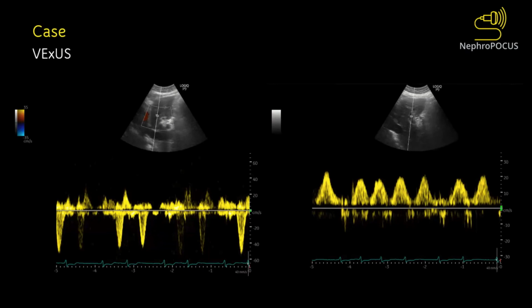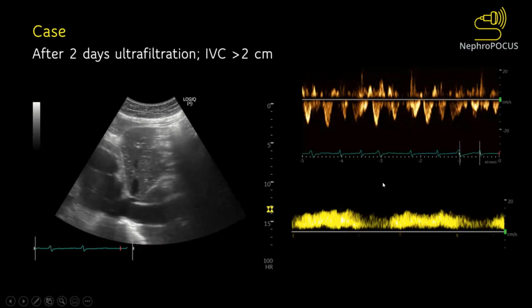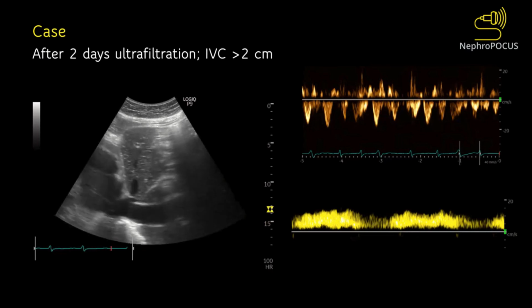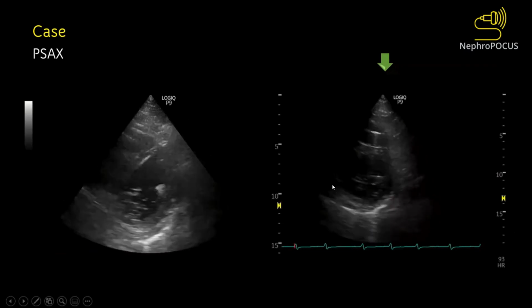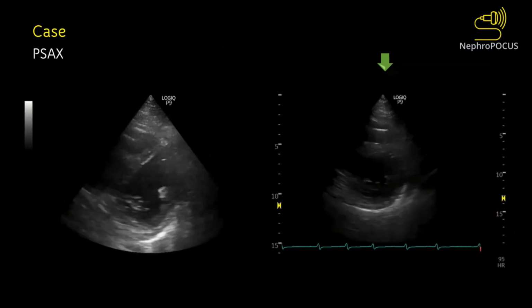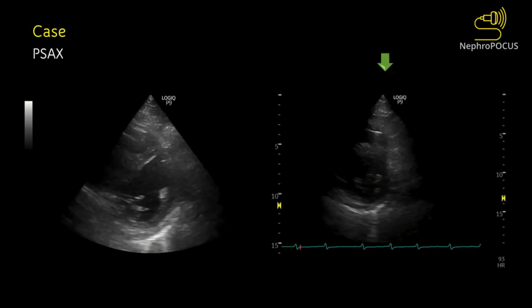So we started him on ultrafiltration. And after 2 days of ultrafiltration, IVC was still big, but you can see that the hepatic vein nicely shows both systolic and diastolic waves below the baseline. And the portal vein has slightly increased pulsatility, but is pretty close to normal. So this is how we monitor the efficacy of decongestive therapy, despite IVC being on the bigger side. And very interestingly, the D-shaped septum disappeared and the LV became round. This is one of the interesting scenarios where if you ultrafiltrate the hypotensive patient, that hypotension might actually improve, because you're removing the volume and the RV is no longer pushing on the LV and compromising the output.